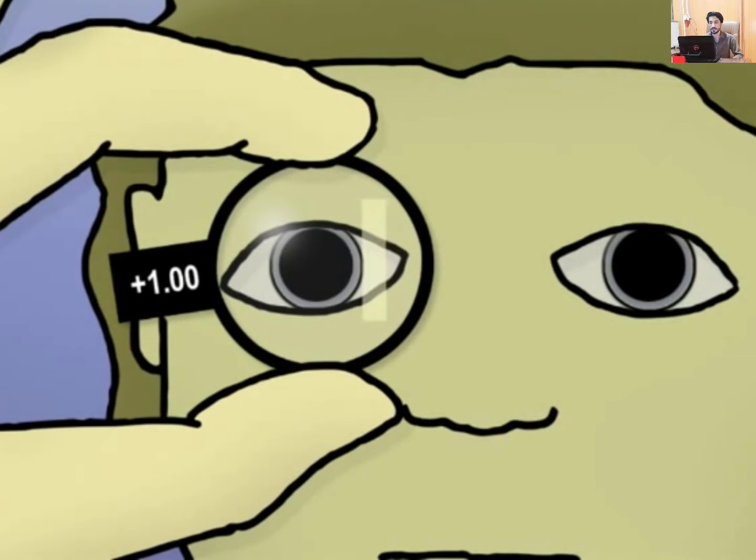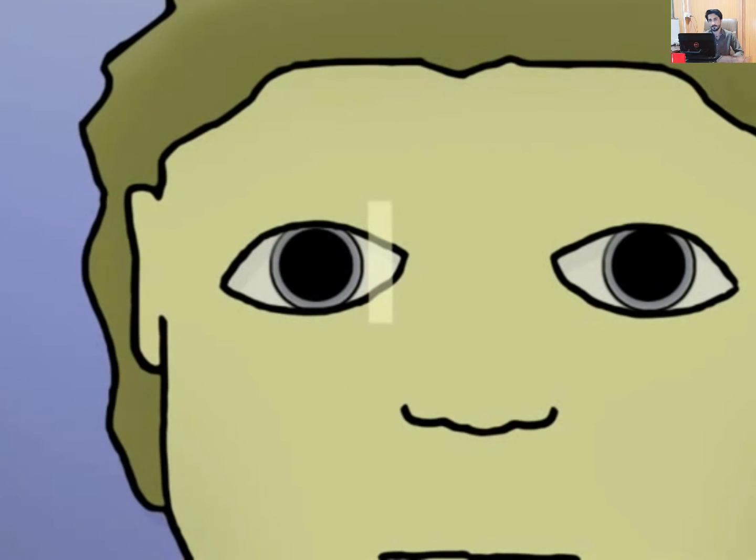So let's hold up a plus one lens, add a little bit of power. And the light, the reflex is still going in the same direction. So we're not quite there yet. You notice that the red reflex, that line back there, looks a little bit thicker than it did before. So it's gotten a little bit bigger, but we still have with motion.